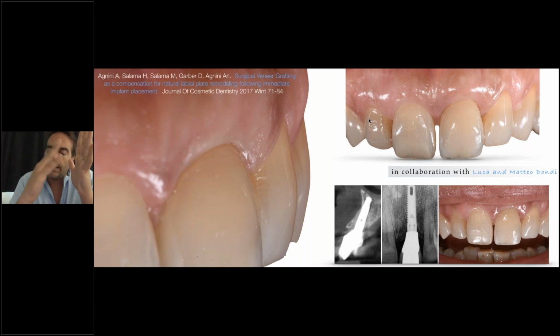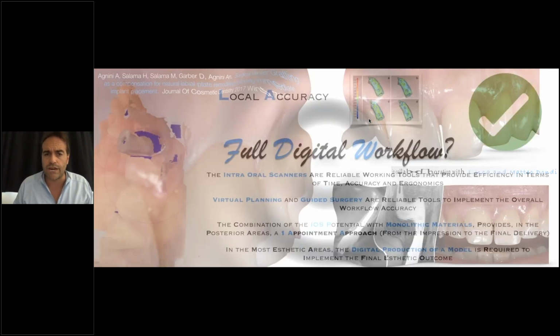The guided surgery helps us in positioning the implant properly, and then we finalize this restoration, always in a digital fashion, but keeping the big picture. So this crown looks nice not only thanks to the intraoral scanning, but thanks to the scan bodies, thanks to the lab technician, thanks to the T-base, thanks to the digital analog that we have utilized.